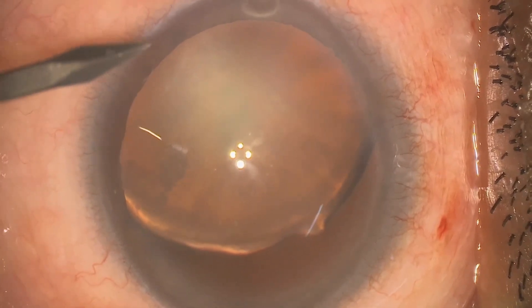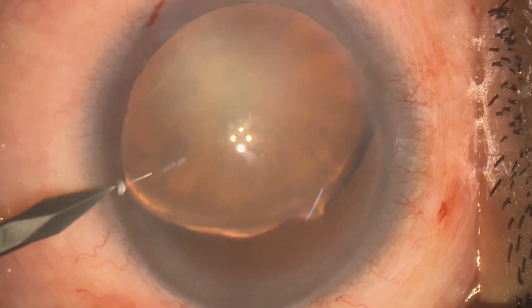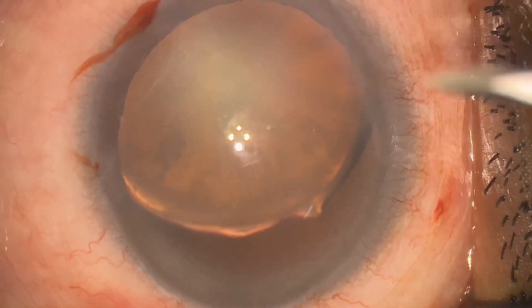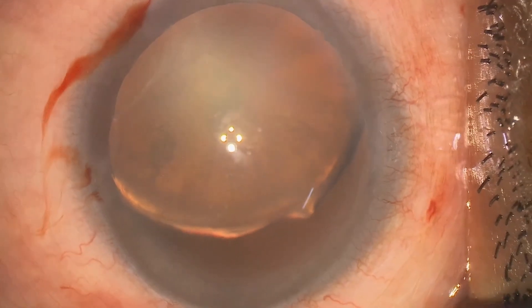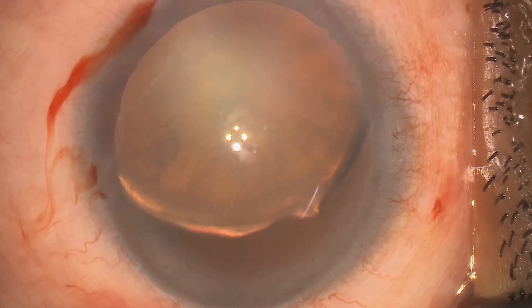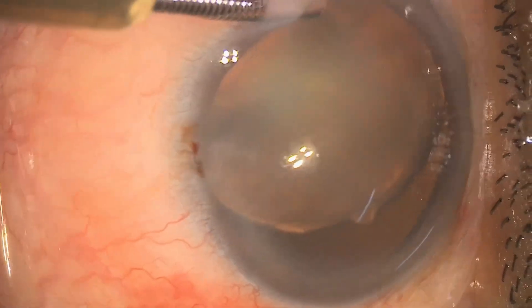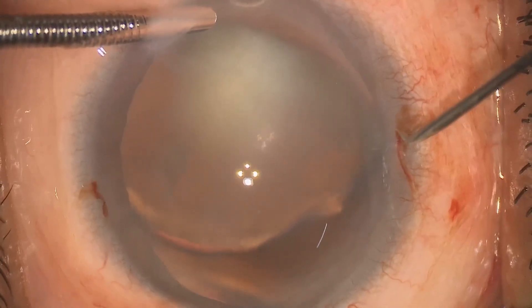Here we are making around 1 to 1.5 mm oblique incision for the AC maintainer, and two more side ports around 1 mm and 150 degrees apart from each other for better manipulation of the instrument. Now here comes the AC maintainer, which we will insert first in the AC and remove last from the AC. We should insert it with a rotational movement, and around 1 mm tip should be inside the AC.